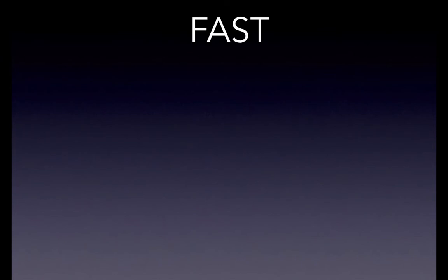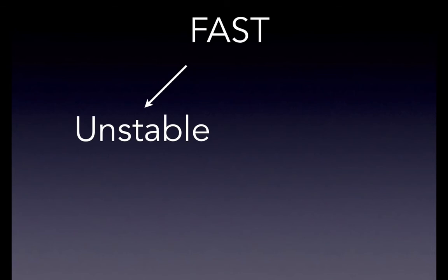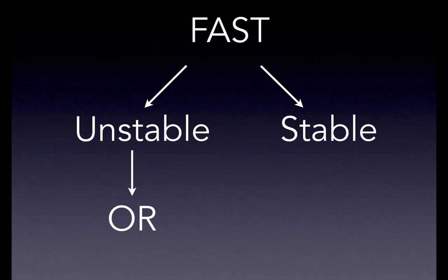patients. You'll do it on every trauma patient. If you're unstable and it's positive, you're going to go to the OR, right? If you're stable, the surgeons might want to run you through the scanner to see if there's any other traumatic injury. Remember, the ultrasound is great. It'll pick up the free fluid in the abdomen, but it's very, very low yield for solid organ injury or mesenteric injuries. If you have a hematoma within your bowel wall or anything in the retroperitoneum, it's obviously not indicated. So you'll need another imaging modality such as a CAT scan.